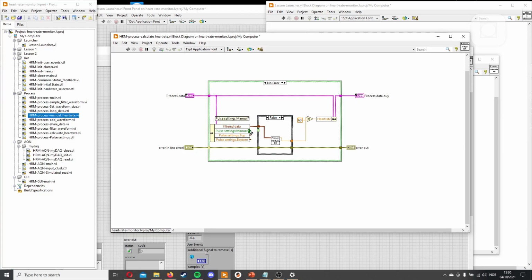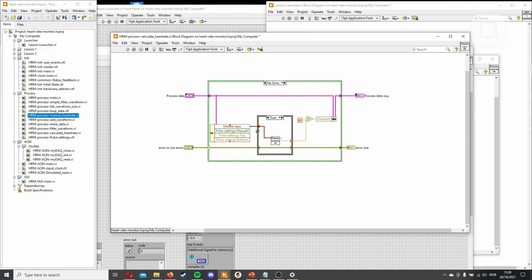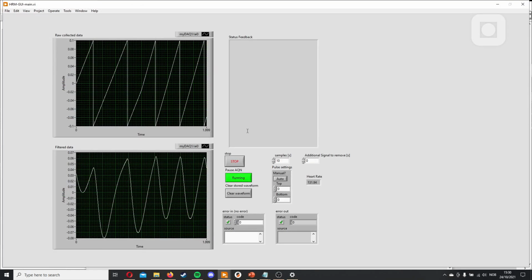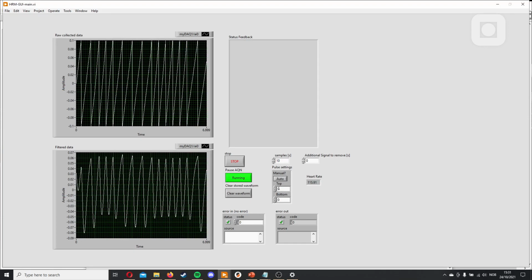So is it manual? True. Well, so we need to change these. So now, is it manual? No, false, then it does this automatic one. And if it's true, then it does our other one. Let's take it for a test now. It's automatically on the auto one, so we see that.